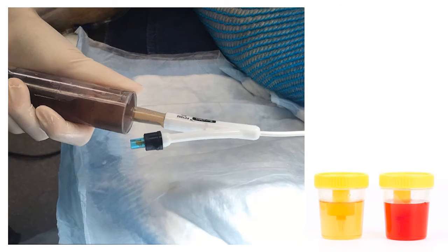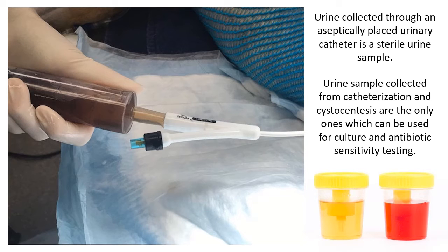Urine collected from an aseptically placed catheter is what we call a sterile urine sample. This sample, along with urine collected through cystocentesis, are the only samples that can be used for culture and antibiotic sensitivity testing. A free-catch sample — collected while the animal is urinating — must not be used for culture and sensitivity, as it can easily be contaminated by bacterial flora in the urethral canal, prepuce, or vulva. You can use that sample to check for stones, but not for culture and sensitivity testing.